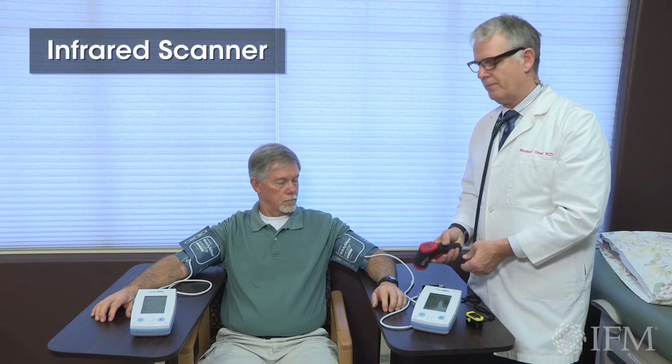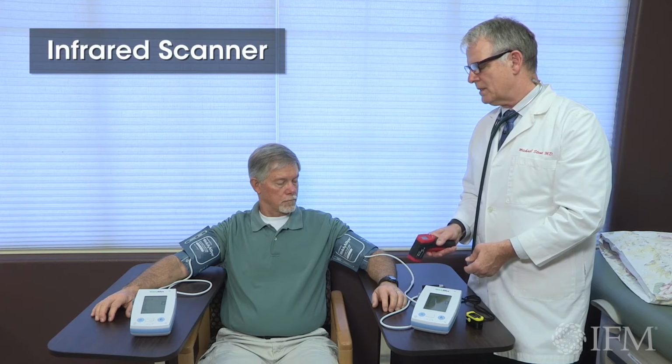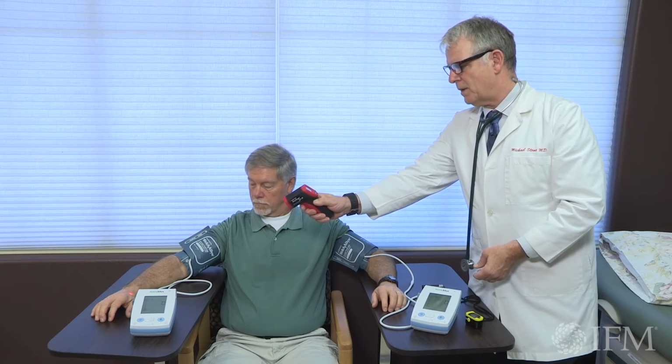on each side. If there's any asymmetry, then you consider checking autonomic balance in each side, which the blood pressure cuffs help. The other thing you can do, and you've seen this tool before, is use the infrared scanner to look to see whether there is a difference in the temperature at the same spot on each upper extremity. There is no difference. So that would also clue you to, I need to see if blood flow asymmetry is occurring.